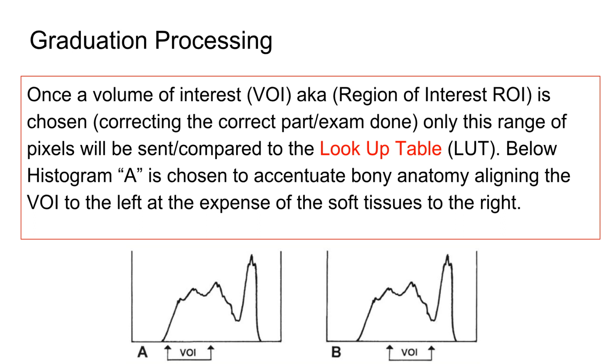And there are rules that govern the grayscale. Part of the DICOM rules that we'll talk about in another class make sure that your grayscale that you see matches the grayscale that they see. And a lot of it has to do with, let's say you had two radiologists, one in New York and one in California, that are both looking at poor Luke Perry's brain scan and trying to see what happened there. You want to make sure that both monitors have the same grayscale, so they're looking at the same image, for example.